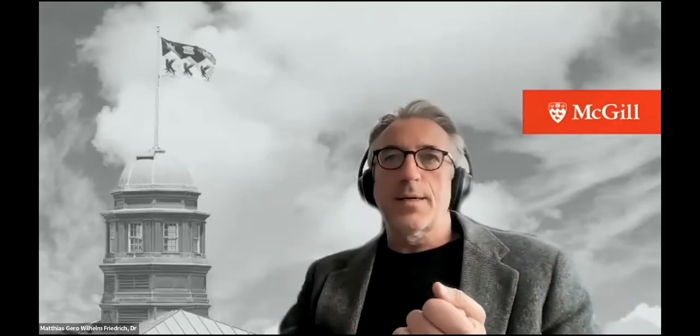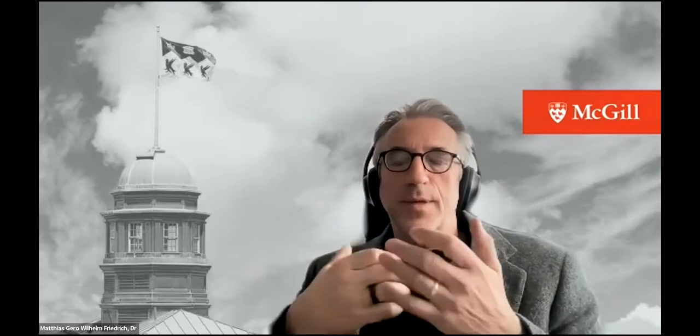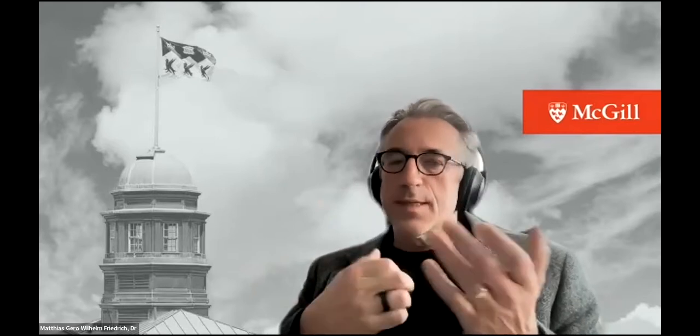Yes. If you have the time and a well functioning T2 map, I would strongly encourage it, because the T1 may be increased because of edema, and we are learning that some diseases may come along with repetitive episodes of microedema with an increased T2. We have seen that also in hypertrophic cardiomyopathy around the RV insertion points. These are also more stressed than others. So that would be very interesting to look at.